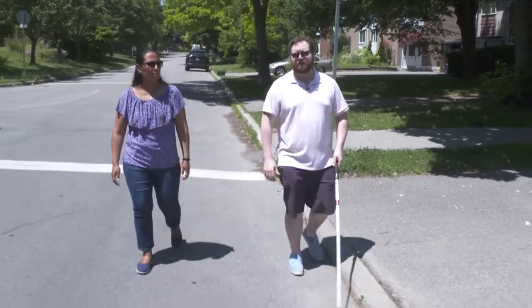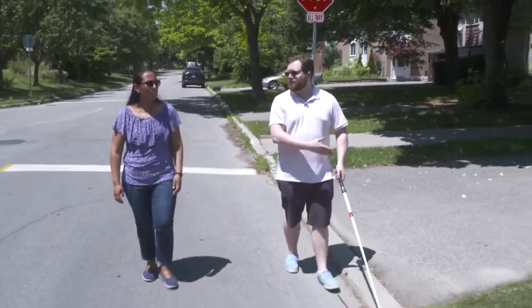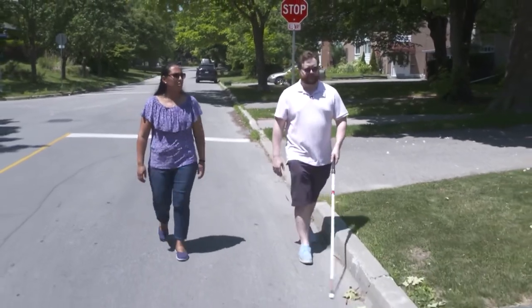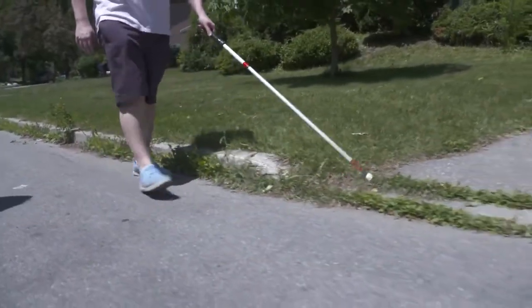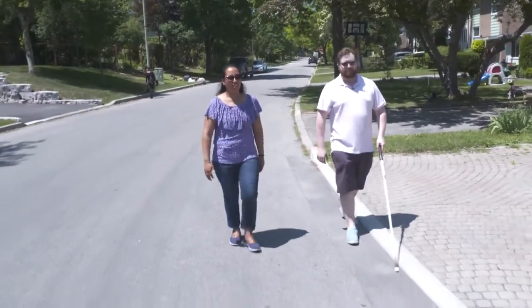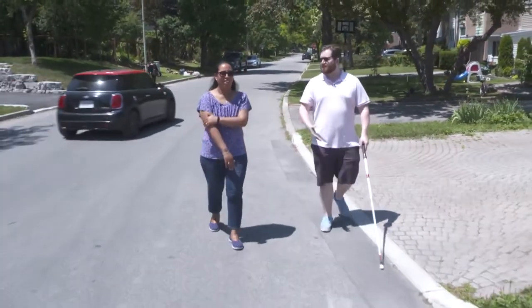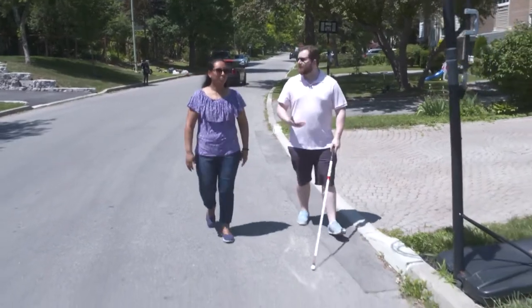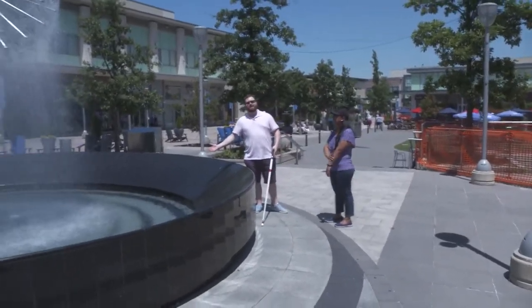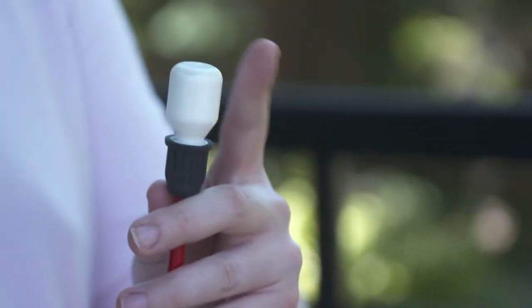Alex Smythe: Because I'm hitting the curb, I get the feedback that there's a barrier on the side, so I know I need to be close to it. Anita Laurinaitis: Exactly. Nothing is consistent, unfortunately, in the city — the world is not designed for blind people, so we're managing our way through it. They continued to explore and manage the outdoor spaces, and Alex got more comfortable using the cane.